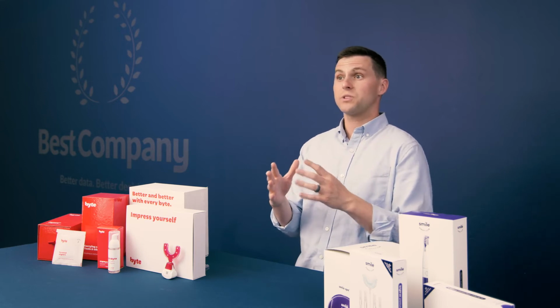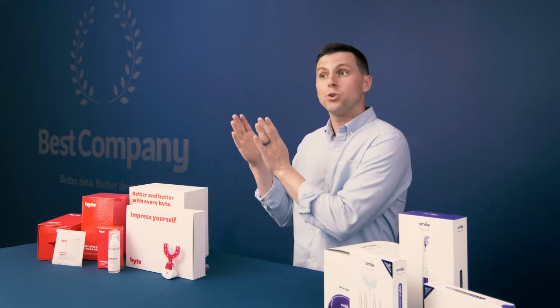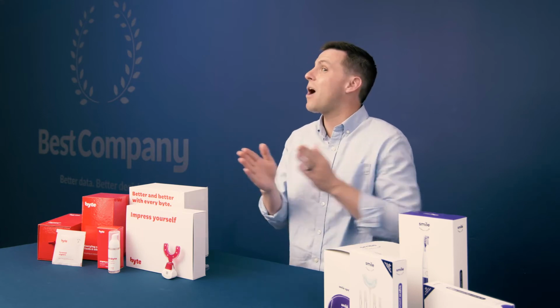About a month after purchasing your aligners, you're going to receive all of them at once, and there's gonna be specific instructions in there telling you which aligner to wear at what time and how long you need to be wearing those. And just so you know, your teeth are gonna be sore, especially those first 24 hours of wearing them. It's not overwhelming, but it's gonna be moving your teeth right from the start, and each aligner that you put in there is gonna be moving them more and more.